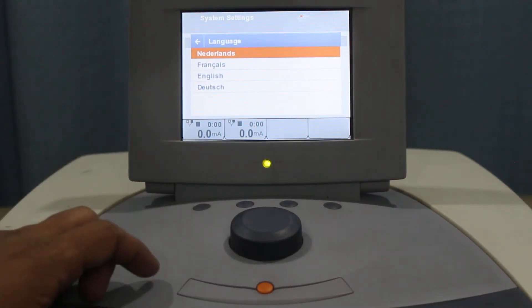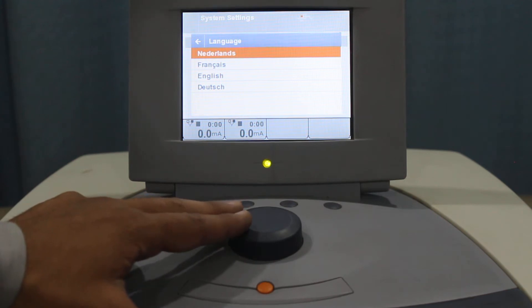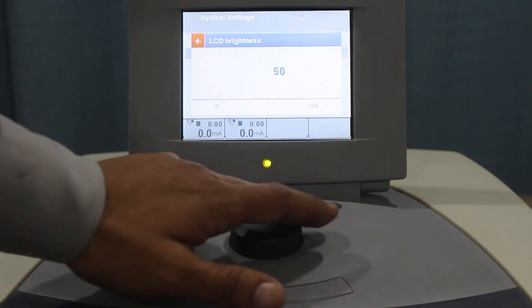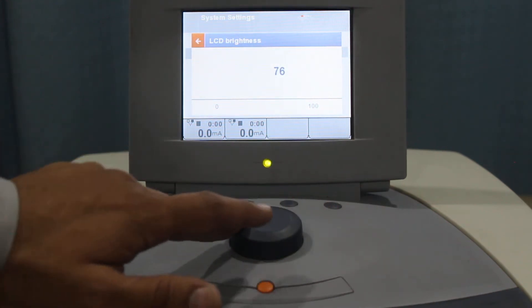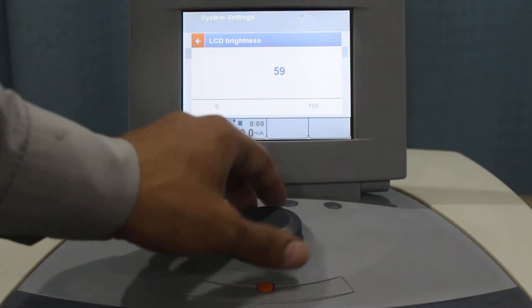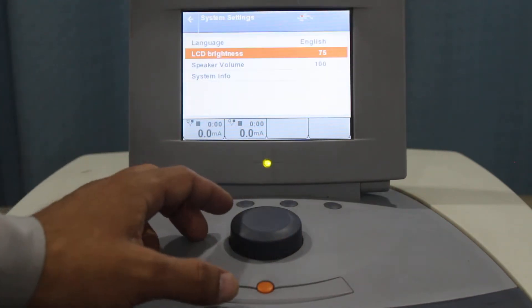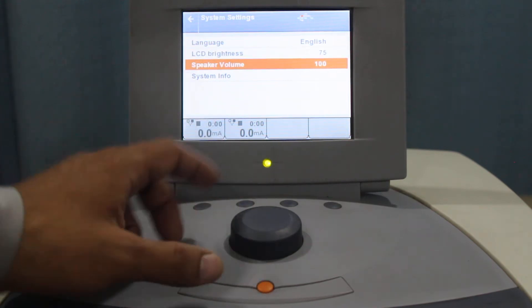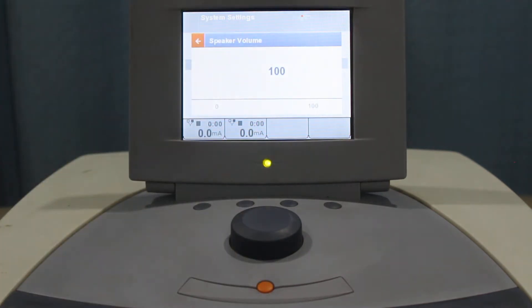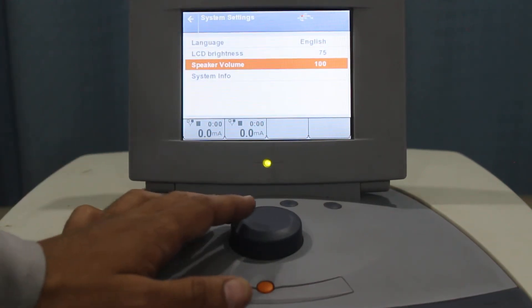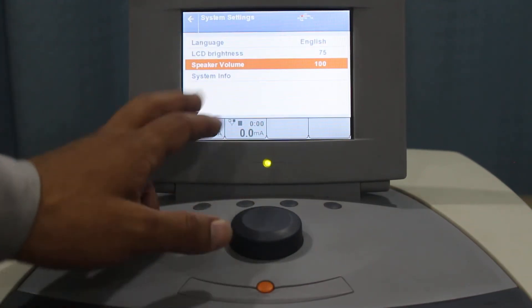If we go to System Settings, you can clearly see the language, which can be changed. You can choose from four languages: Netherlands, French, English, and Deutsch. The brightness of the LCD can be controlled — from very bright to very dim — so we'll keep it at 75%. The speaker volume can also be adjusted; if you want the stimulation to be accompanied with a beep, you can increase it to 100%.